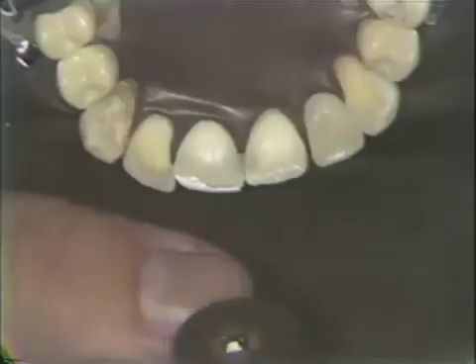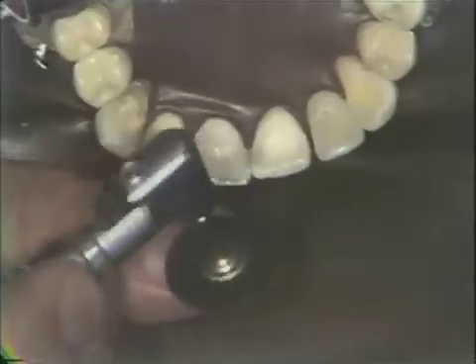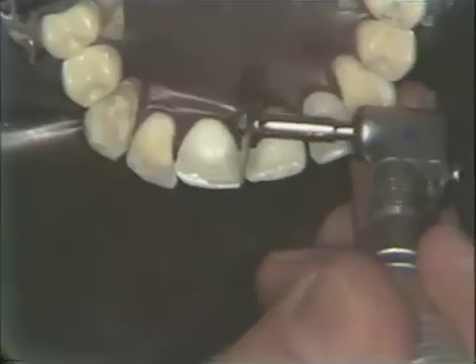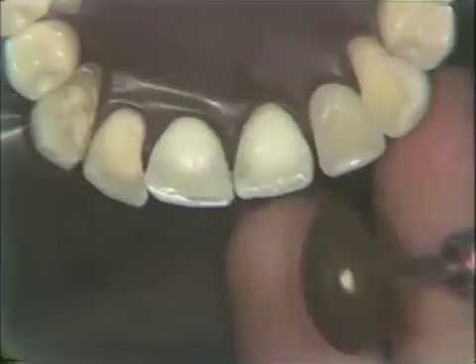Now with the discs, we will break the back of the disc on our fingernail. Just gently press it against the back of the disc, against your fingernail, and press, and it loosens that up for us so that we do not cut ridges into our restoration.